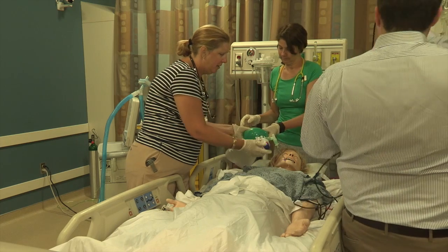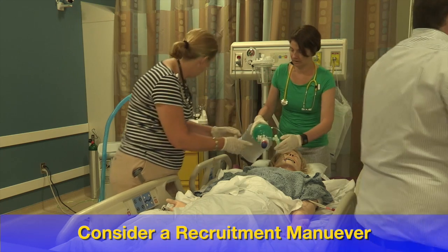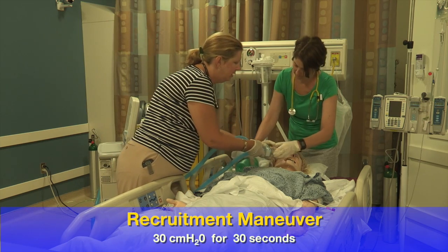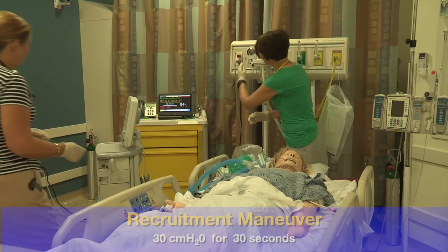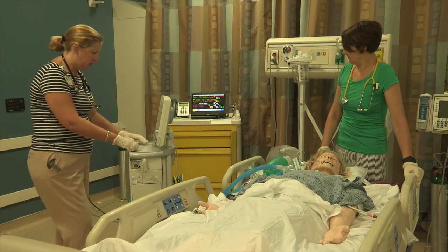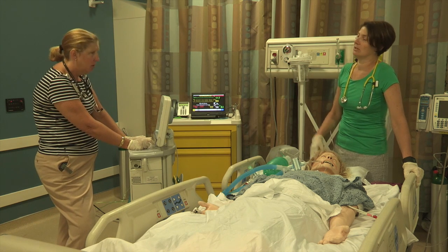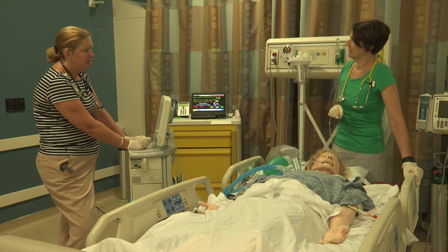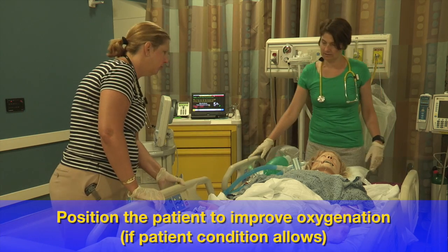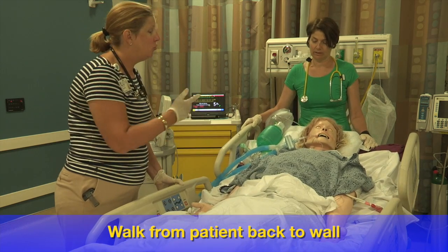With that right side being down, I think we should probably try a recruitment maneuver to see if we can blow open those alveoli. Let's put her back on the ventilator — we'll do 30 centimeters of water for 30 seconds and just watch for hypotension. Going back to her original ventilator settings: respiratory rate of 14, inspiratory pressure of 18, and PEEP of 10. Actually, let's go up to PEEP of 12 and start with 100% and titrate down as we move forward.